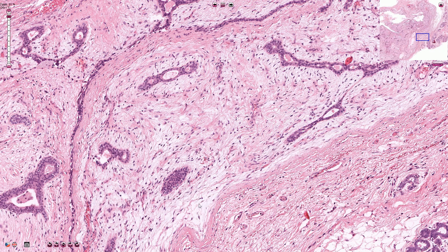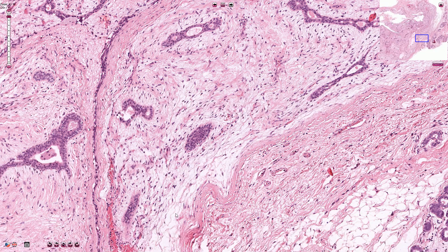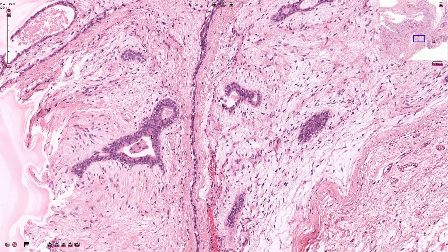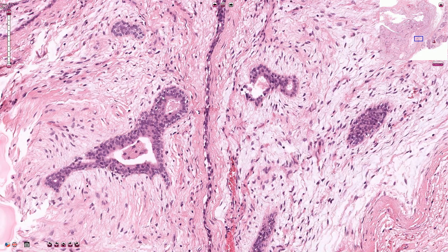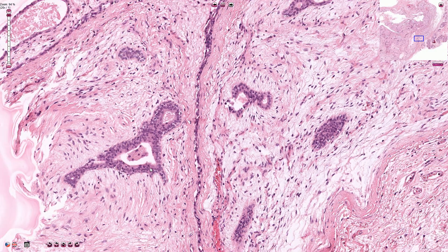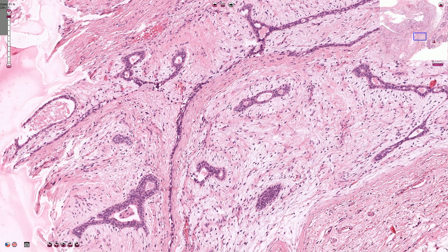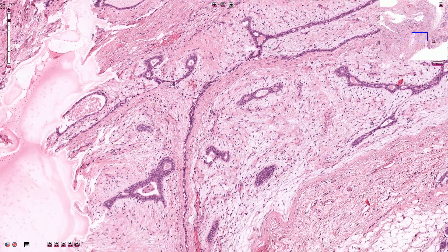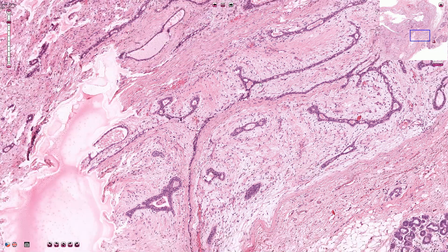This case of fibroadenoma is associated with quite a myxoid, loose fibrous stroma — myxoid appearance is common among younger women, while hyalinized stroma is more common among older patients. We can also appreciate these compressed ducts which form the epithelial component. Being a benign lesion, we can see two layers of cells: the luminal cells and outer myoepithelial cells. Many fibroadenomas are associated with mild epithelial proliferation or hyperplasia; however, atypical ductal or lobular hyperplasias are very rare, and ductal or lobular carcinoma in situ or infiltrative carcinoma within fibroadenoma are extremely rare.